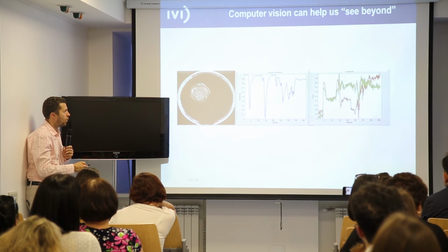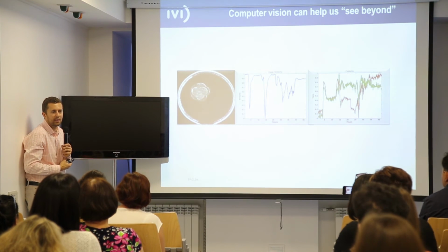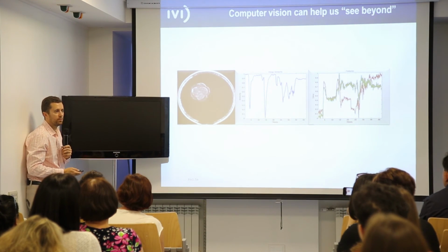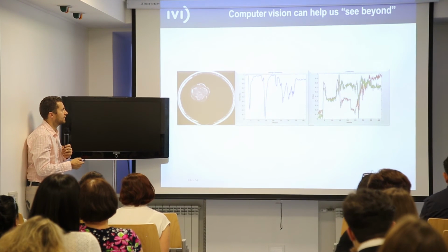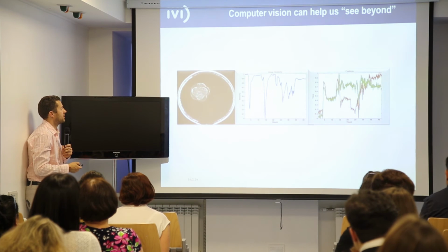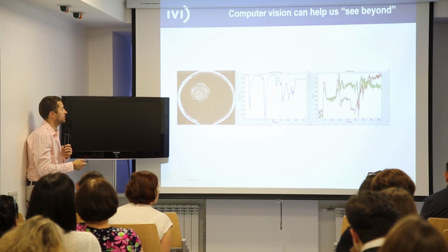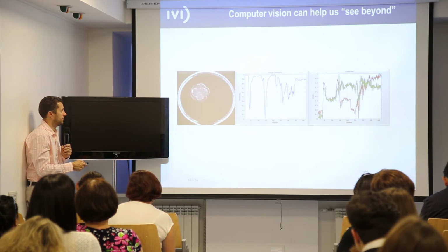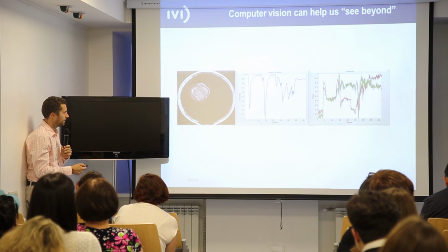So what if we can go deep in that graphics and maybe get the extra information that is potentially useful for the embryo? So let's say that there are some graphics here that are related with the cleavage. Every time that the embryo cleaves, there's a change in the pattern of the aspect of the picture, but also there are changes in the shape of the blastomeres.